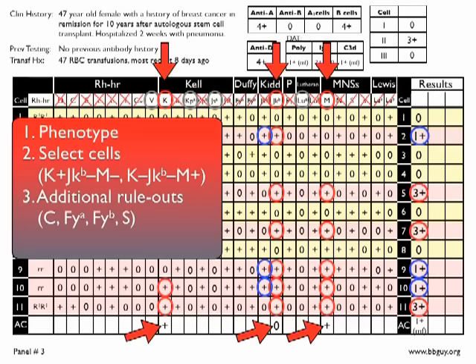So enzymes would potentially help distinguish between these, in particular between the JKB and the big K antibodies, because the JKB antigens are strengthened by incubation with enzymes, so the antibody reaction should be stronger.